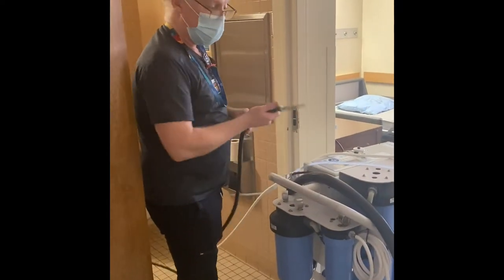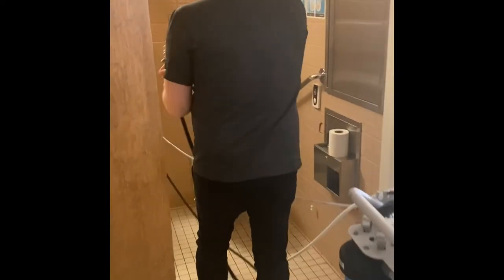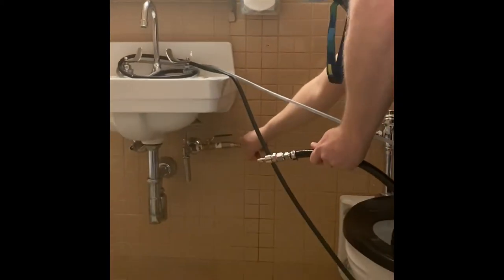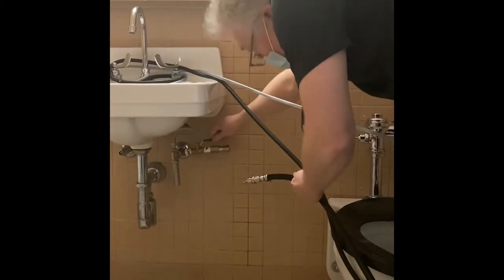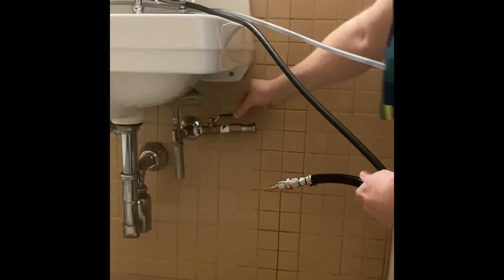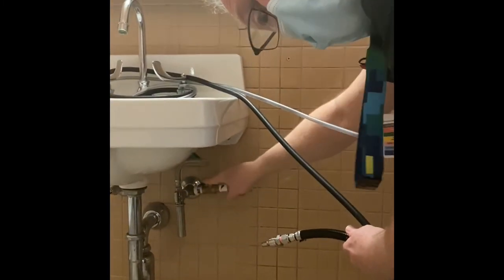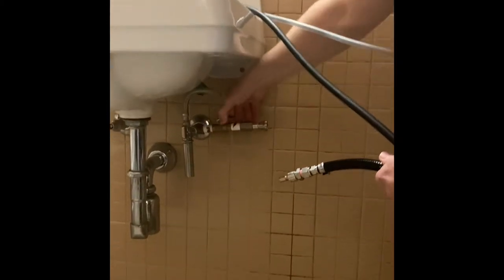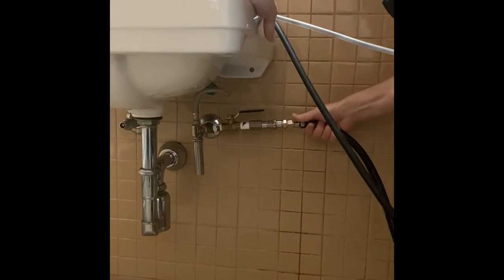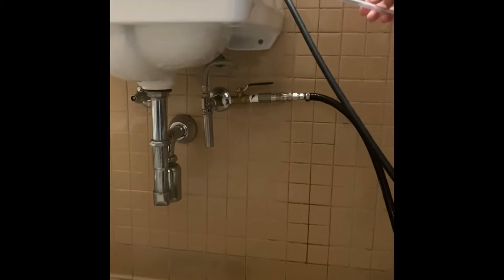Now connect the water supply — remember, keep it clean. This connects onto the quick connect adapter under the sink. Your water supply valve needs to be opened, in line with the water pipe. The quick connect will not connect if your valve is closed, so make sure it's open. Then simply push into the connector — you'll hear a click and it's ready to go.